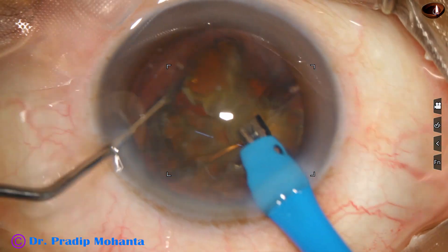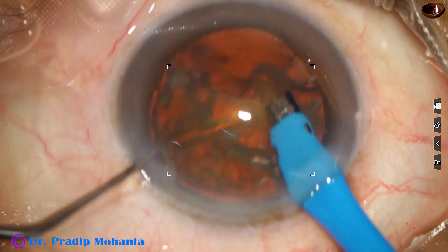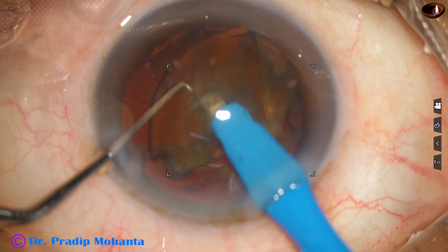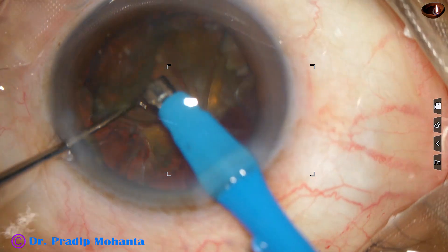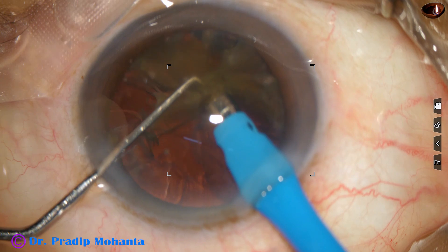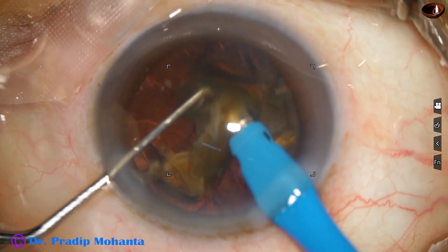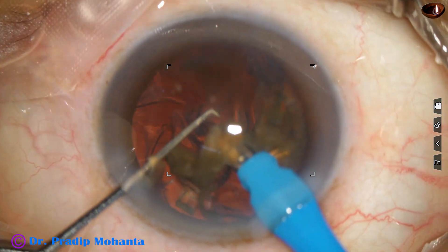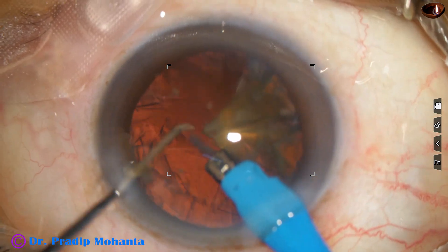The nuclear fragments are being chopped one by one. Ultrasonic energy being used is set at 80 percent in continuous mode, but not 80 percent all the time — I am using the ultrasonic energy very judiciously, intermittently, whenever needed. This is the technique when two pieces are not separate: just tilt it and apply a little energy at the apex or at the band joining the two fragments, and the two fragments become separate.